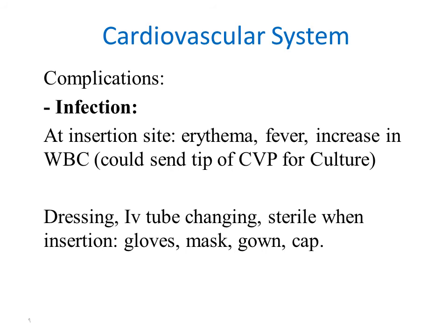The complication of central venous pressure monitoring is infection at the insertion site: erythema, fever, and increase in white blood cells. We can look for the culture. Regarding dressing and IV tube changing, use sterile technique when inserting: gloves, mask, gown, head cap, and so on, in order to avoid any infection.